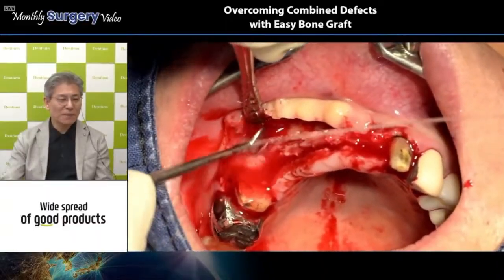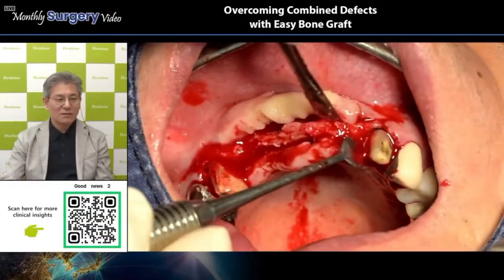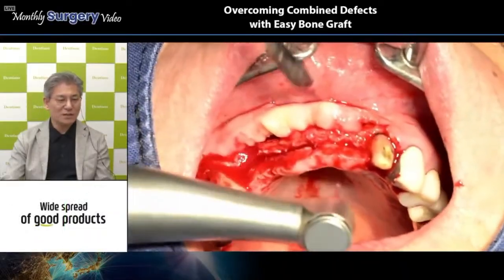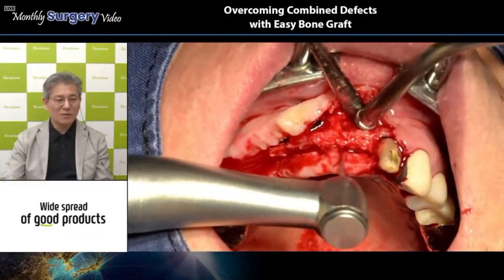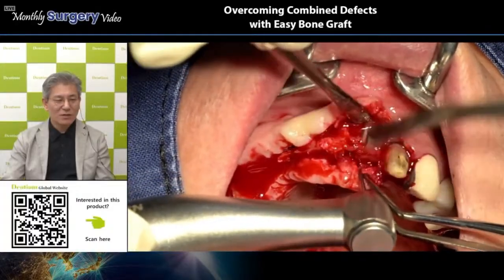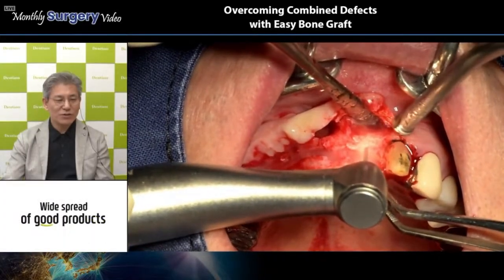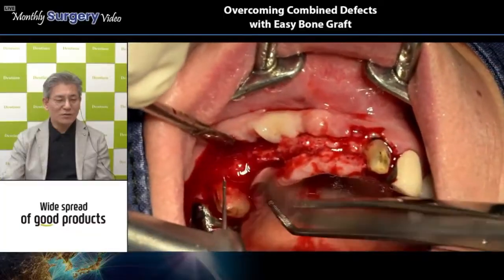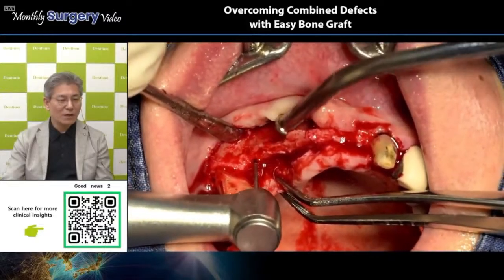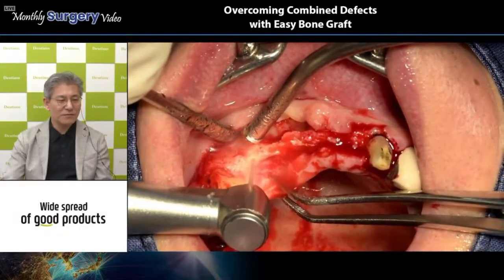So, let's see. Okay, after flap reflection, he made the crestal incision and the vertical incision, and is checking the proper position, using a high-speed small round bar to make a position for the initial drilling on the number 21 area. Okay, this area is the 14 area actually, the long-span situation, as I mentioned before.